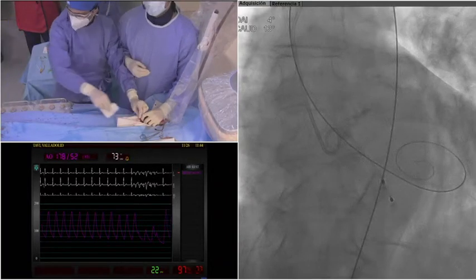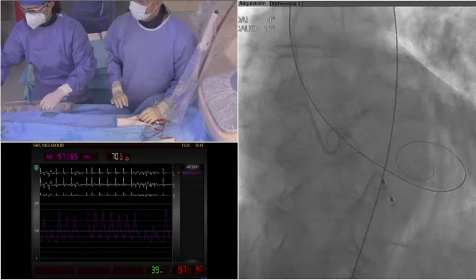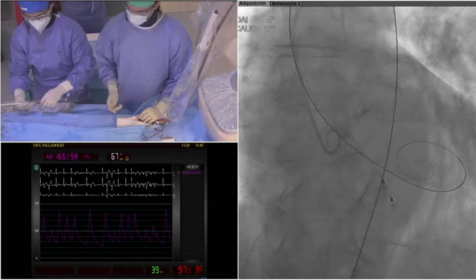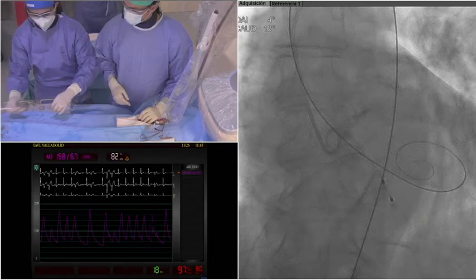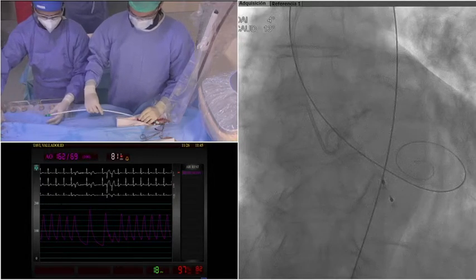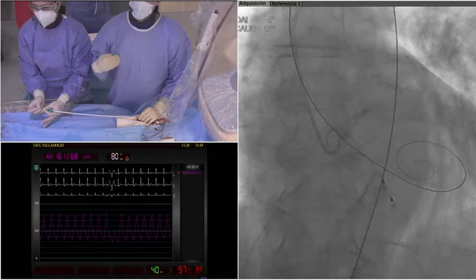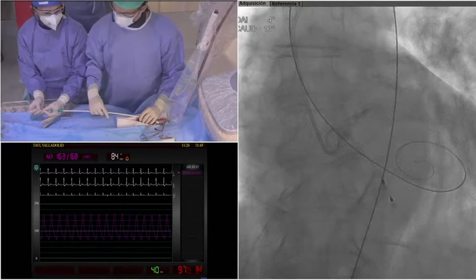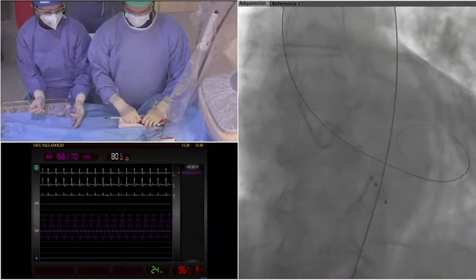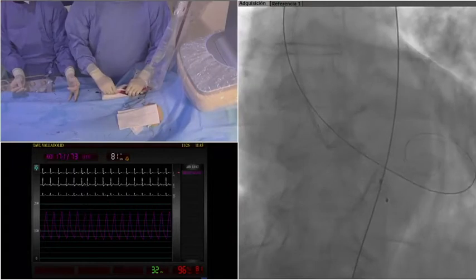Now we insert the other one. So there is one maneuver recommended with this introducer, especially for larger sizes, from 27 ahead, which is dilating the introducer with one dilator a little bit larger. It's the same size of the valve. So it doesn't mean that we are going to a larger size, but this is just to diminish the resistance. Okay, now it's done.